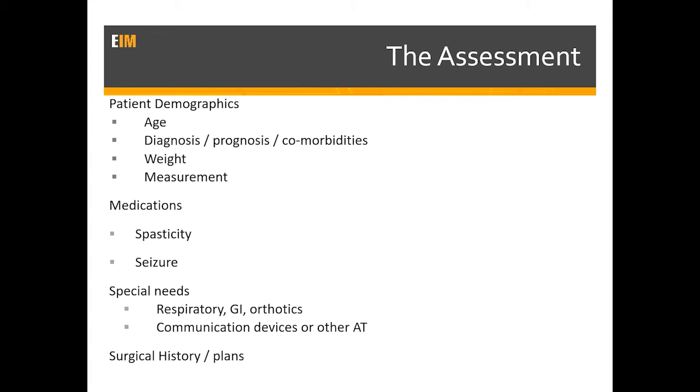The other big category in this special needs is communication devices, or tablets and iPhones, smartphones, that assistive technology category, where they really need to have that device mounted securely and safely onto the chair because they use it periodically when they're at school or when they're at home. So can that thing be carried safely? Where does it get stowed during transportation? Is it safe on there? It won't fall off and break. Is it safe? Nobody will pinch it, won't get stolen.